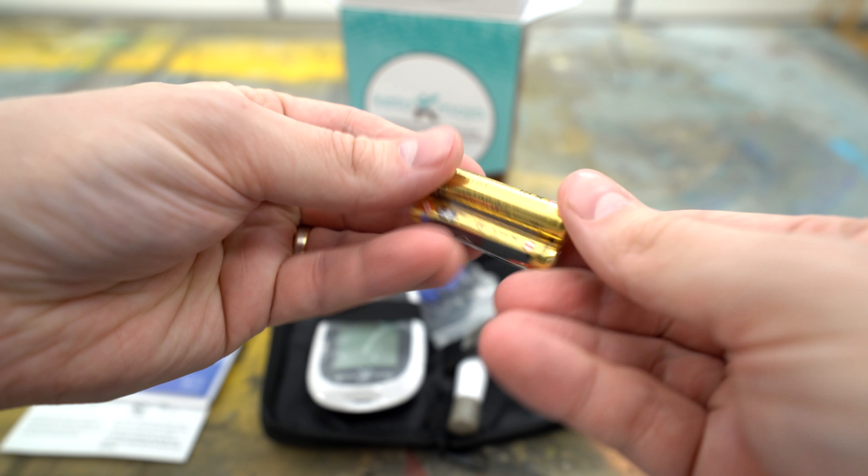And then the last thing was just a set of batteries — you do get a set of batteries included with it. We'll see how long the actual unit itself lasts with one set of batteries.